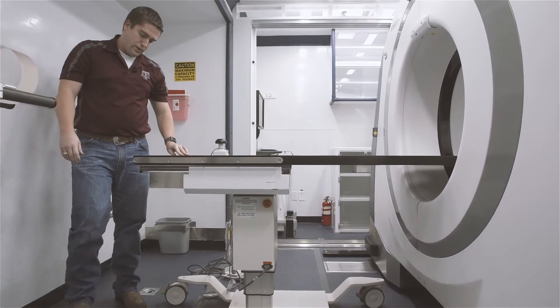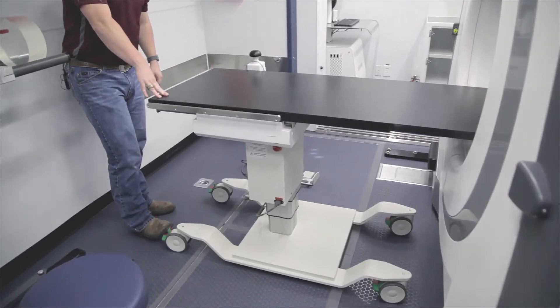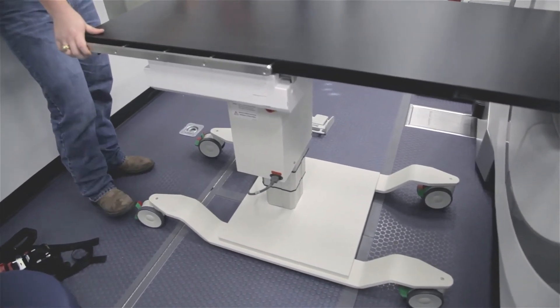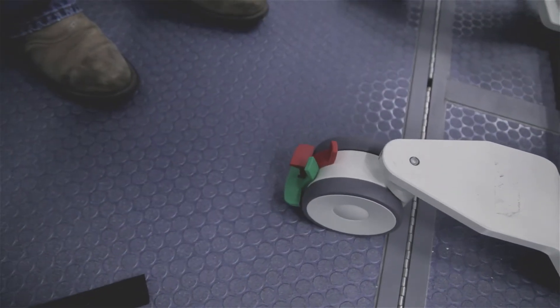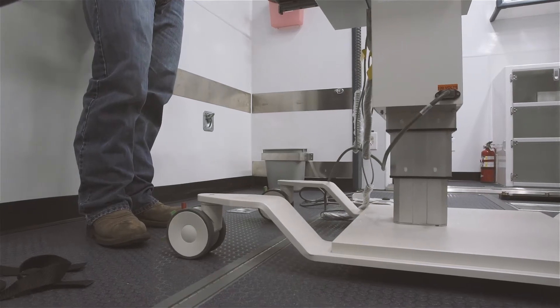Down here at the wheels we have two functionalities. In red we have the wheel brake, which locks the entire unit in place. If you hit just the green, that's a steer lock — that makes sure this wheel can't pivot anymore, so you always have a straight in-and-out path for the table.